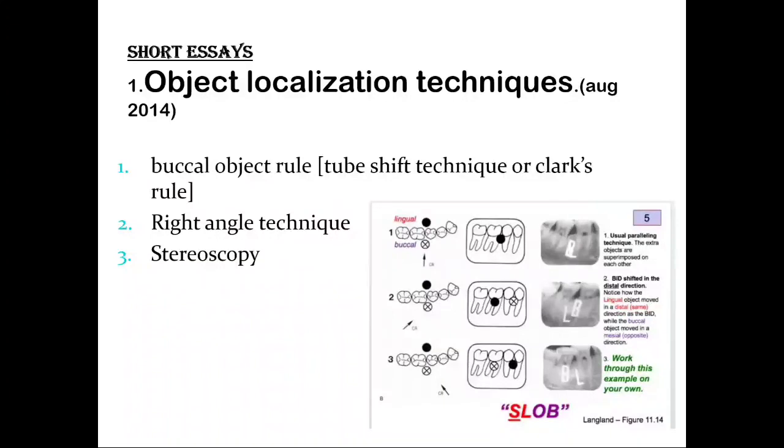Then you have stereoscopy, which helps to determine small intracranial calcifications and foreign bodies in dense or thick sections. Stereoscopic imaging exposes two films, one for each eye, so it delivers twice the amount of radiation to the patient. Between the exposures, the patient is maintained in position, the film is changed, and the tube is shifted from the right eye to the left eye position.